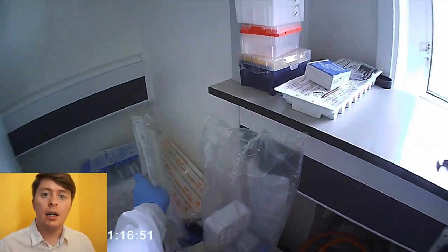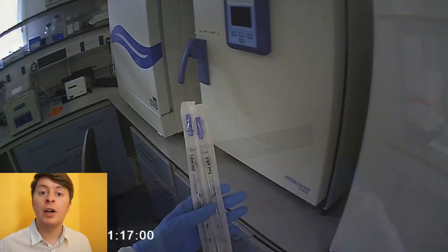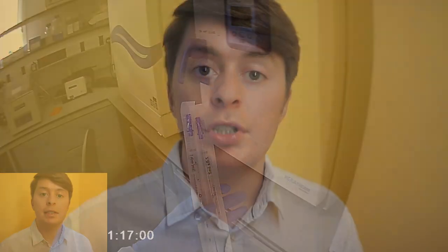So as you can see here, I grabbed some 5 mil stripettes. It was 5 mil stripettes because I was starting a new cell culture. So I had my frozen T cells, or Jurkat T cells, in the minus 80 freezer.